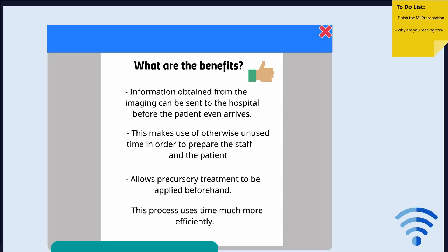This subsequently allows for staff both within the ambulance and at the hospital to obtain useful information regarding the cause of the stroke and location of the problem long before they would have without the technology. This thereby allows the staff to better prepare both themselves and the arriving patient, while staff back at the hospital can diagnose the patient under less pressure.